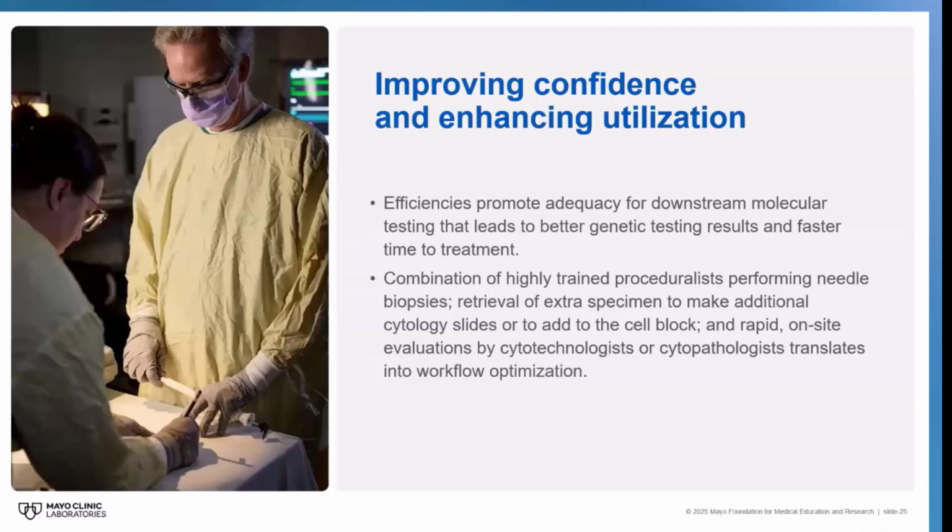We do think that this promotes efficient teamwork procedures and workflows. We're able to have communication between the procedurist, the cytotechnologist, and the cytopathologist in order to get the most bang for our buck on the material that we have. If we have a cell block made, our cytopathologists can ask for more cuts up front. If they know they're going to need more testing to help with the actual tumor workup, they will say, I need this many unstained slides up front, so that we don't have to go back to the block more than necessary.